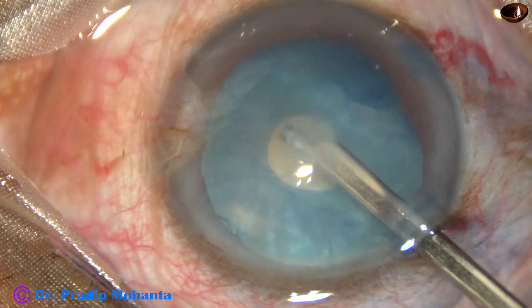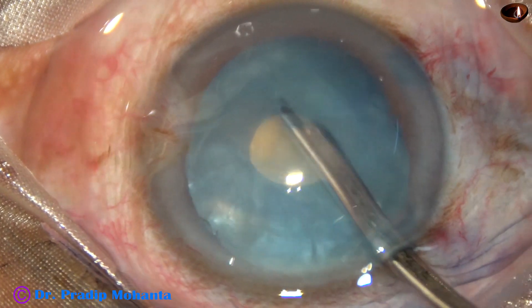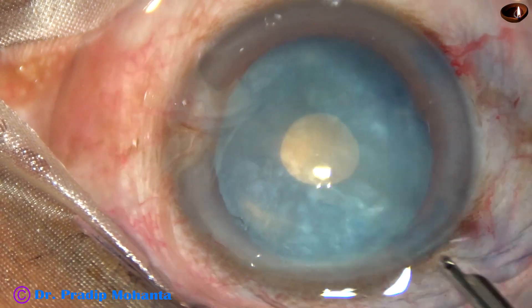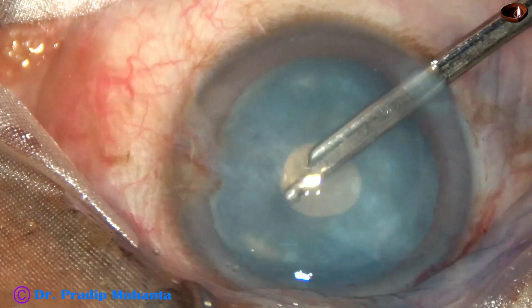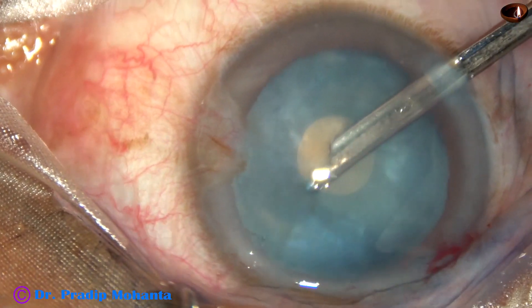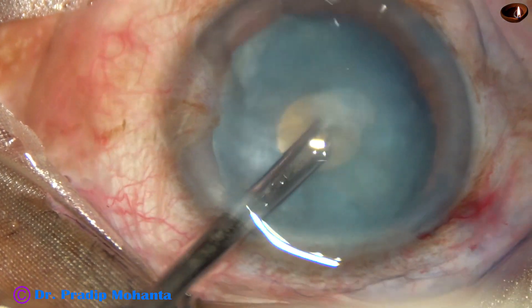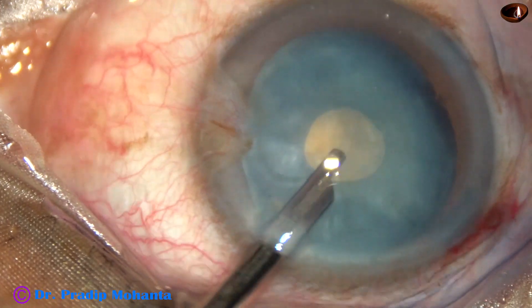I am using a Simcoe 23G. You can use bimanual irrigation-aspiration — whatever you use, remove some cortical lens matter and reduce the intralenticular pressure. I am going through the right side port and removing cortex around the 9 o'clock area. A significant amount of lens matter should be removed. Now going through the left side port and removing cortical matter from around 10 o'clock.